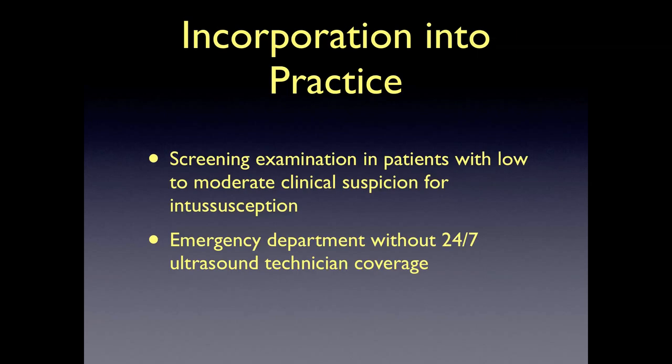Once the operator becomes comfortable using ultrasound to diagnose pediatric intussusception, it can be used as a screening examination in patients with low to moderate clinical suspicion for the condition. This is especially valuable in emergency departments without 24/7 ultrasound technician coverage.